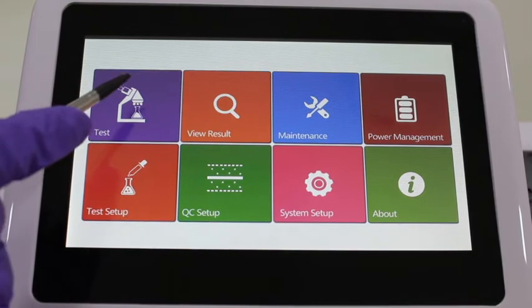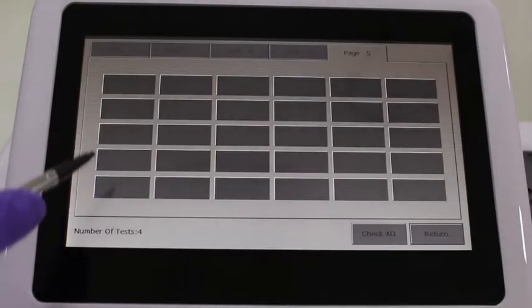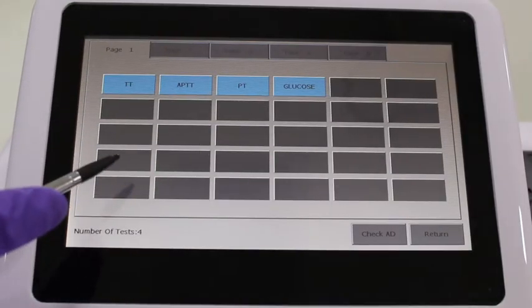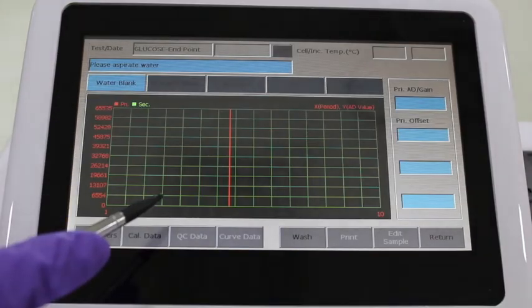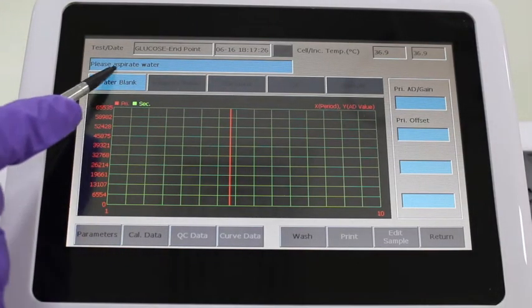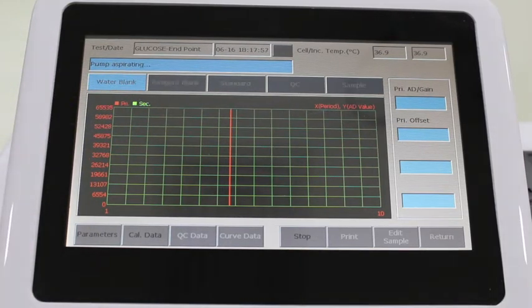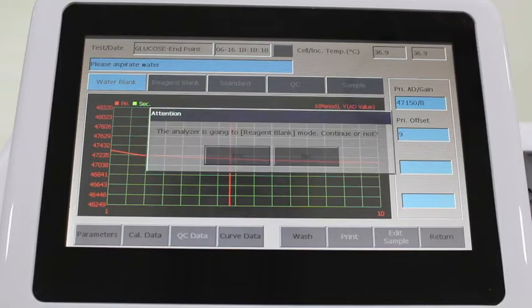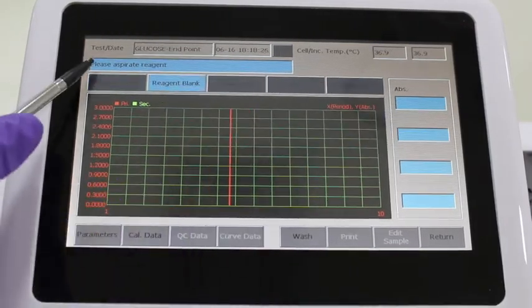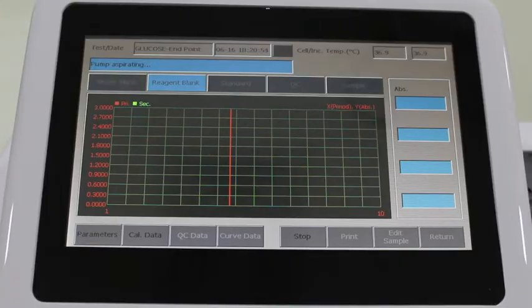Place the tubes including reagent blank in the incubator. Go to the menu screen and select test menu. In that, select the required page and then the required parameter. The testing page opens and message 'aspirate water' is displayed. Once distilled water is aspirated, the display shows 'pump aspirate.' Once aspirated, it displays 'testing in process' and the OD is displayed. Then it is ready for running the reagent blank.